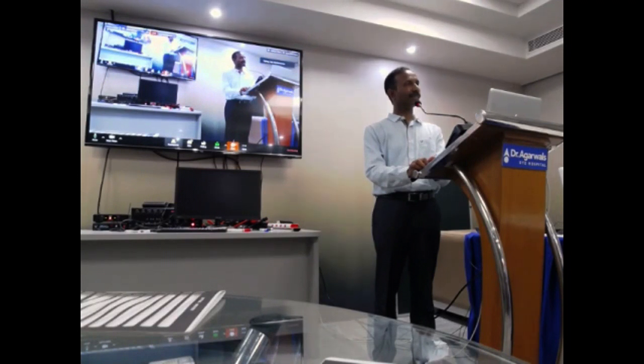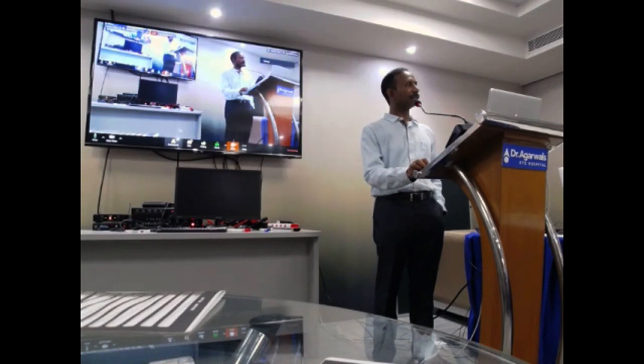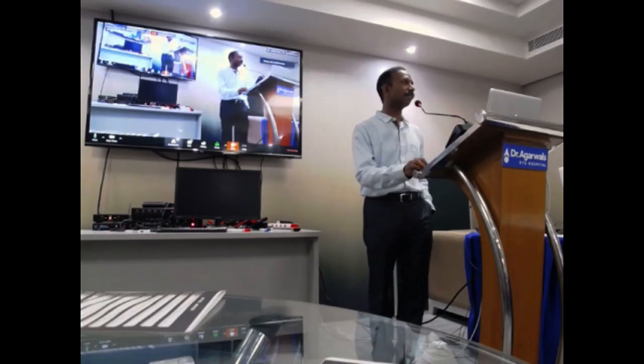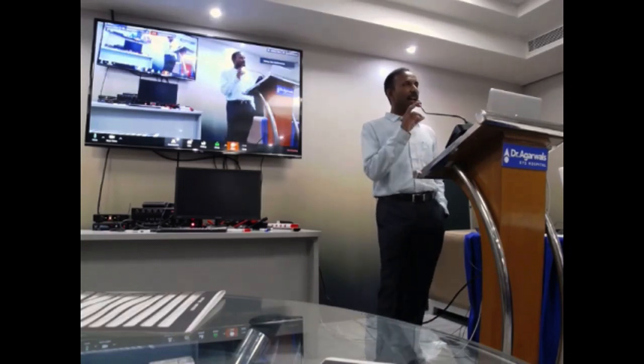We often see patients with retinitis pigmentosa, at various levels of retinitis pigmentosa. It's not that they come to us only in the last stage, right? So there are different stages in which you can offer low vision aid. How do you deal with a patient with RP who has probably just been diagnosed? Do you think we should refer a patient to you when the patient has just been diagnosed with RP with just early peripheral constriction and things like that, or only in the end stage? When do you think a patient is more receptive to accepting a low vision aid?